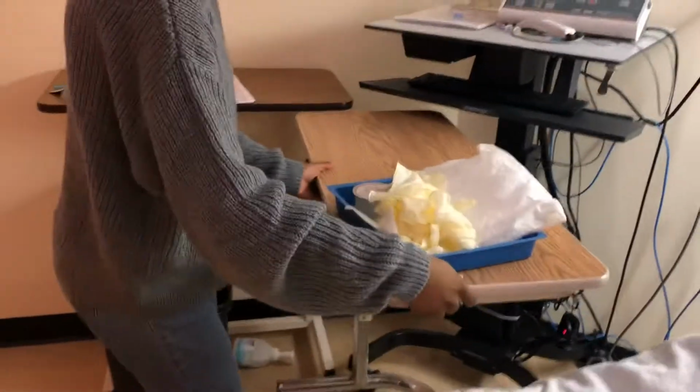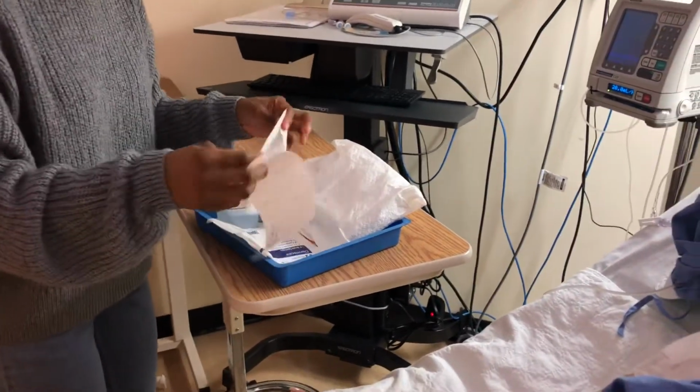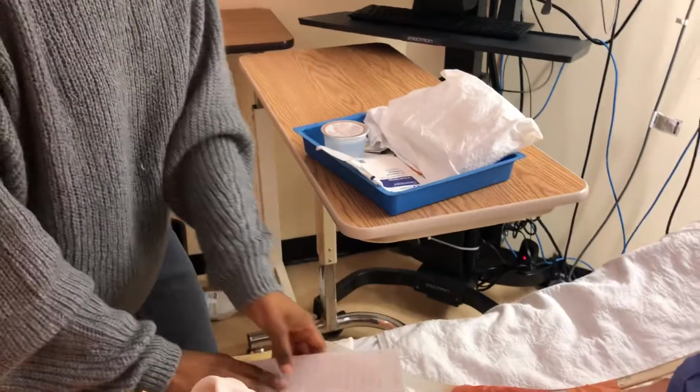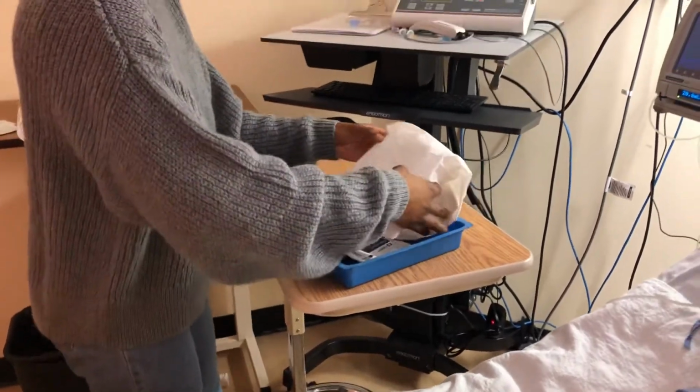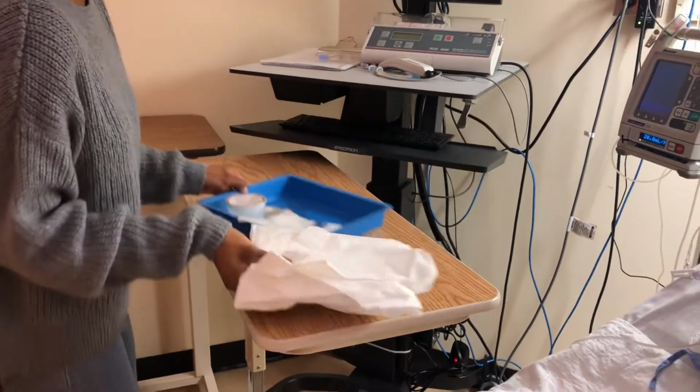So the patient does not need any analgesic, so I'm just gonna leave that here, leave this here as well. So take my dressing tray here.